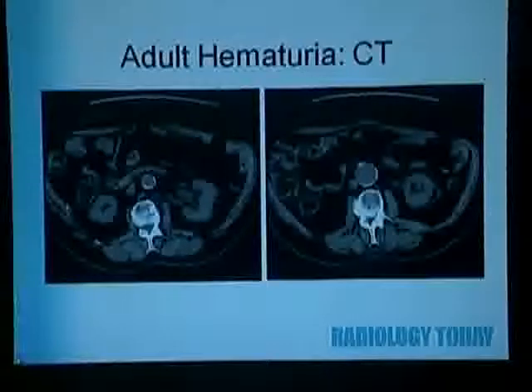Another protocol CT that we'll often do for hematuria, specifically when there is flank pain, is a renal stone protocol. And I'm sure a lot of people here have ordered renal stone protocol CTs. Now, importantly, we do those without any contrast. Okay, so that does limit our sensitivity for some of the solid abdominal viscera pathology. But again, this is a tailored examination based on somebody's clinical opinion.